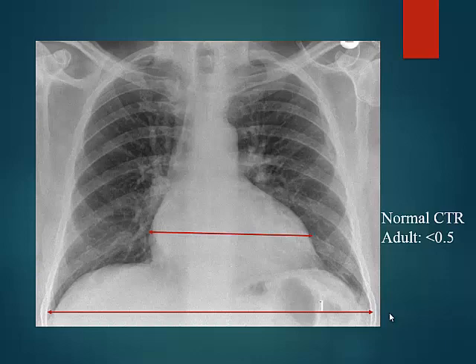So it's a very crude measurement of the heart size. Is it a sensitive way to say if somebody's heart is failing or dilated? When you say sensitive, do you understand what I mean? Is it sensitive to pick up heart failure? It's not sensitive, okay? You can have an absolutely normal size, but a patient with a poor ventricle. But if it's dilated, then it means something is wrong. So I can say it's specific, but not very sensitive.